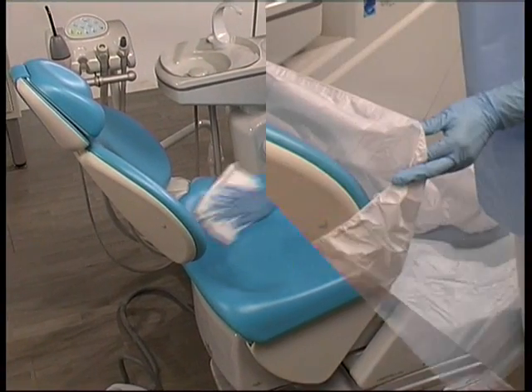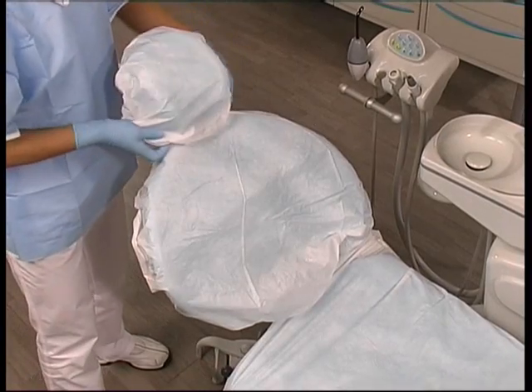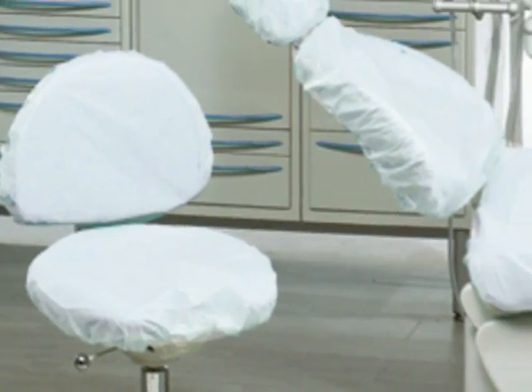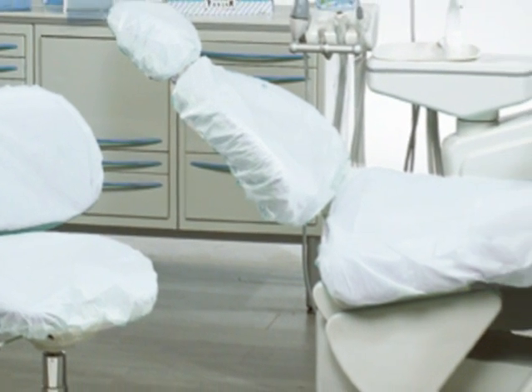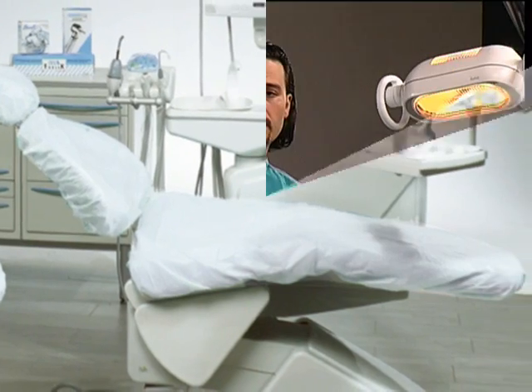The various parts of the dental chair are covered with waterproof, disposable protective materials that act as a barrier. This operation allows us to drastically reduce the risk of cross-contamination. Once the disinfection procedure is completed, the kit is opened.